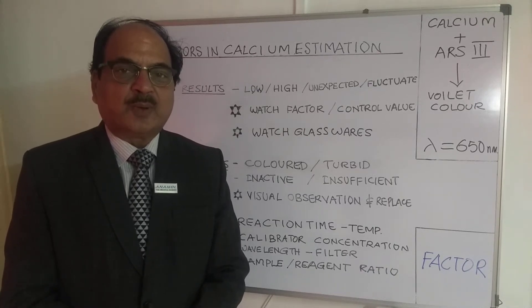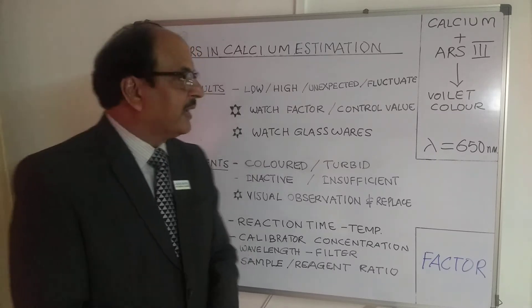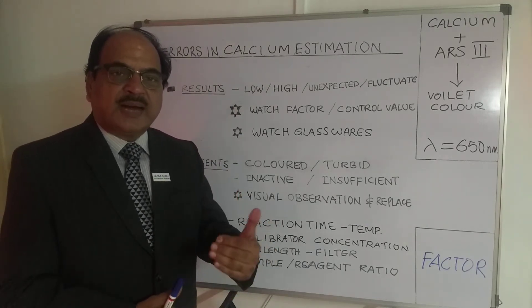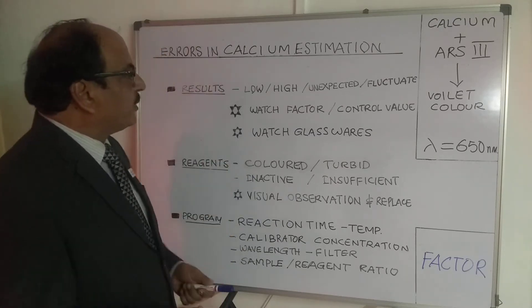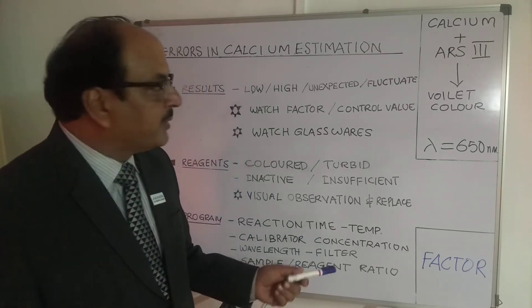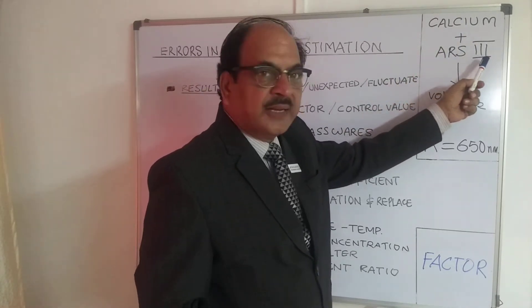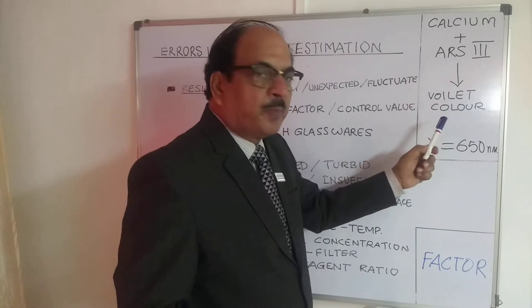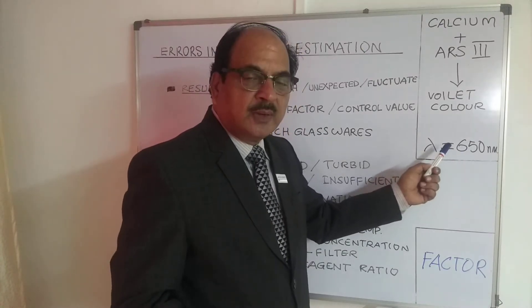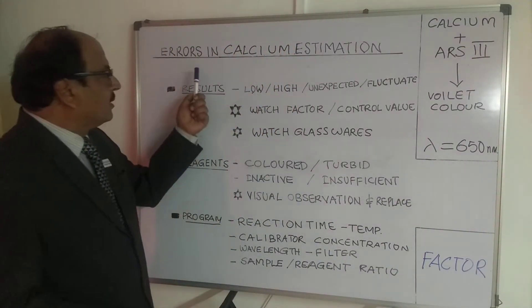Hi friends, greetings from Anambo Laboratories Private Limited. In this series on common errors in clinical chemistry, let's take calcium — specifically calcium estimated through the calcium arsenazo reagent. Before we go into the clinical chemistry errors, let's see how this calcium arsenazo reagent reacts to estimate calcium present in serum. In the presence of arsenazo III reagent, calcium converts into a violet or purple color having maximum absorbance at around 650 nanometers, though wavelengths around 620–630 nm can also be used.